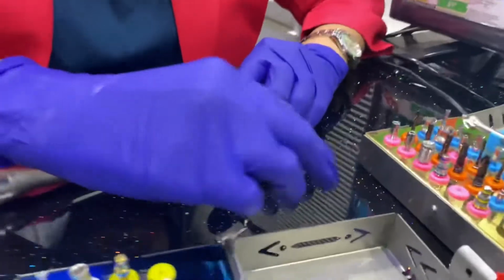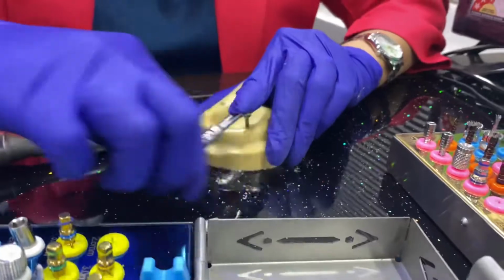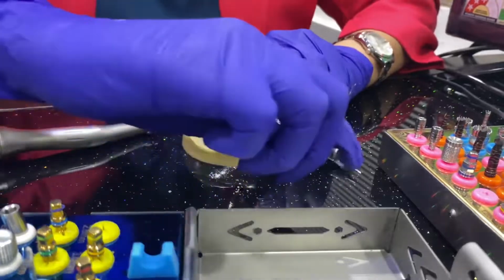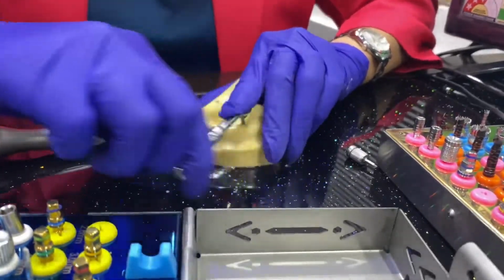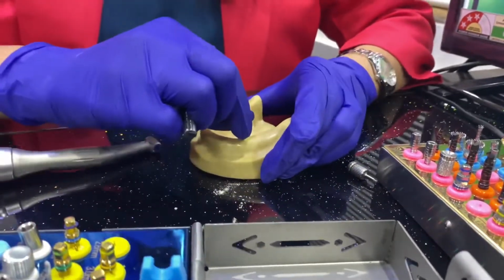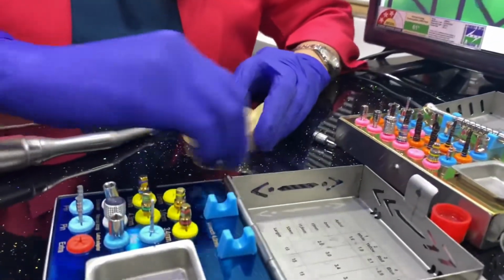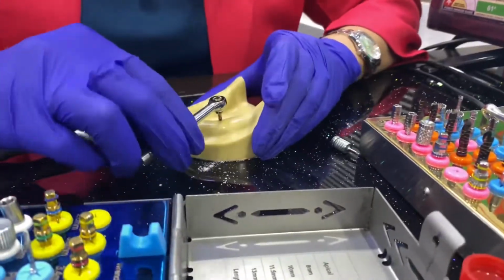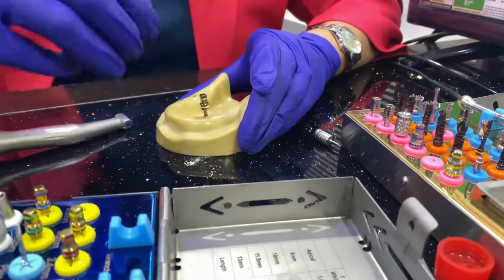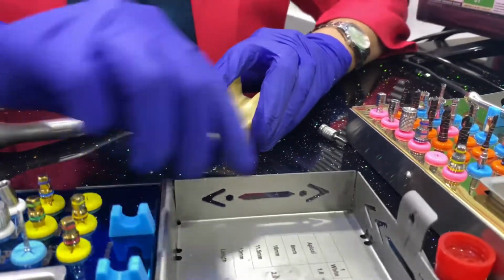So at this point, if you want, you can always take an X-ray. This is how I have gone to my desired length. Now, if you try and remove it, it will not come out. So you have to reverse the ratchet and go in the reverse motion. The same ratchet which we use like this to go inside, we have to use the out motion or the reverse motion and remove our expanders.